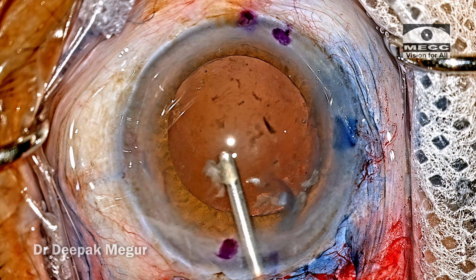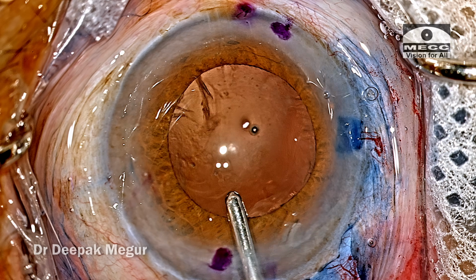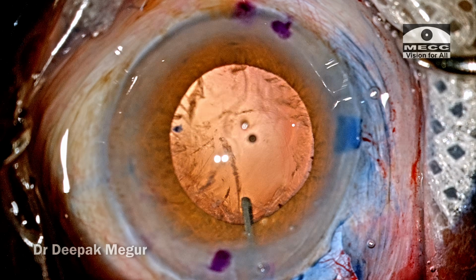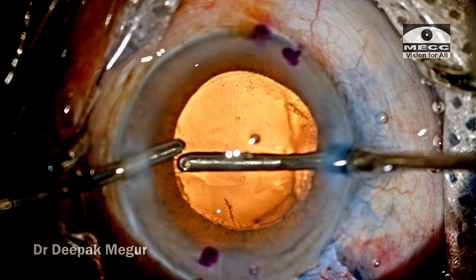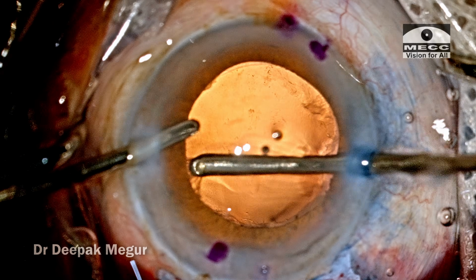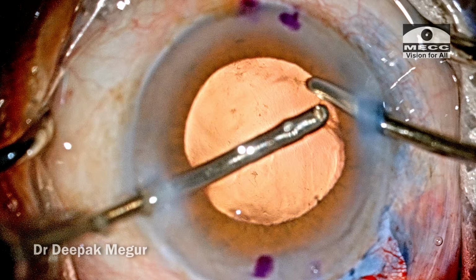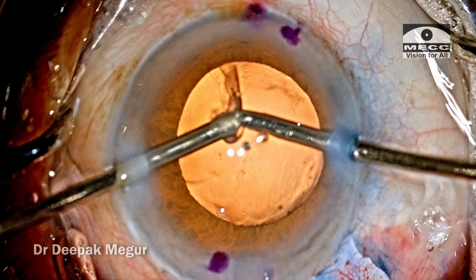Now, in these long-standing cataracts, the cortex will be very peculiar in the sense it will have very few cortical fibers, but it is a pain to remove them simply because they'll be sticking onto the capsule very strongly, and I'm just irrigating out to loosen up these fibers. Invariably, when you're trying to be very meticulous and trying to aspirate this cortex, there's always a risk of either causing zonular dehiscence or a PC tear. So this time I'm reminding myself that I need to be mindful not to overdo the cortex extraction. Gently but surely, most of the cortical fiber is pulled out.